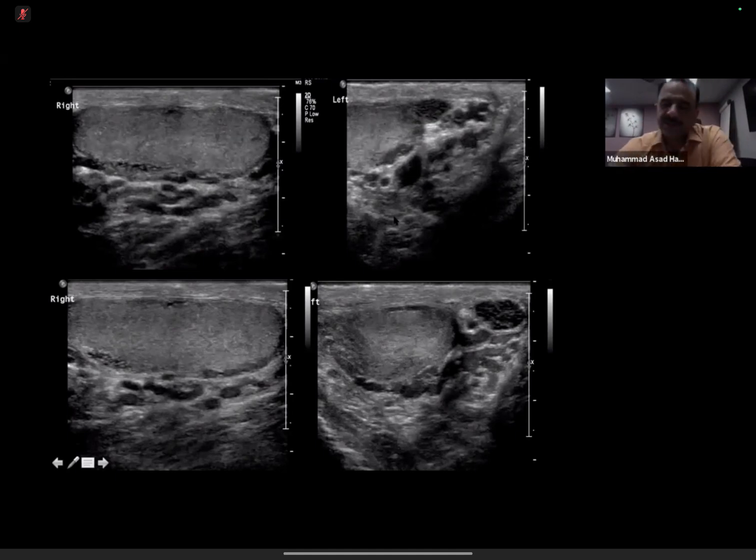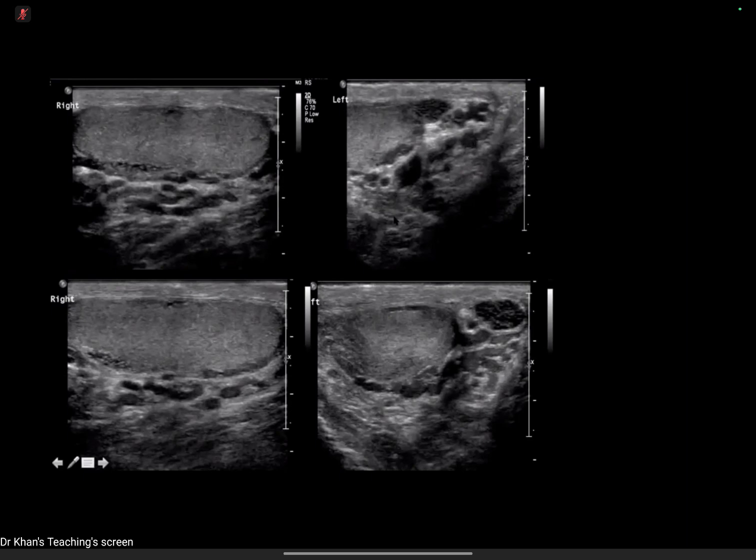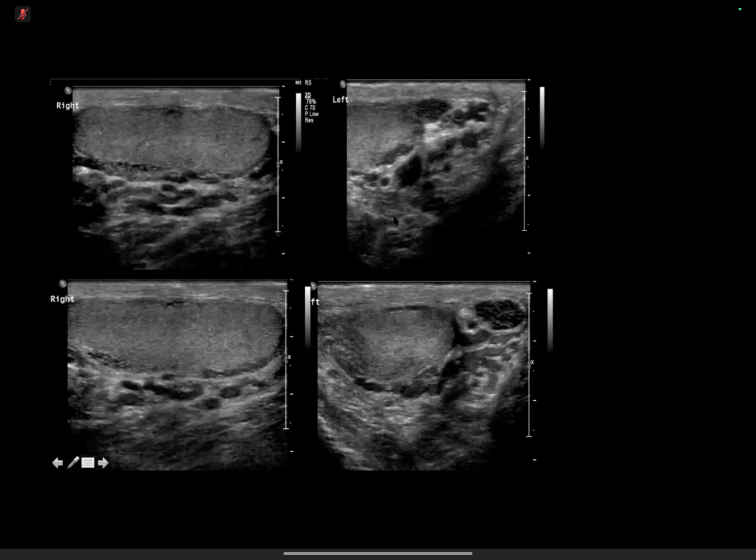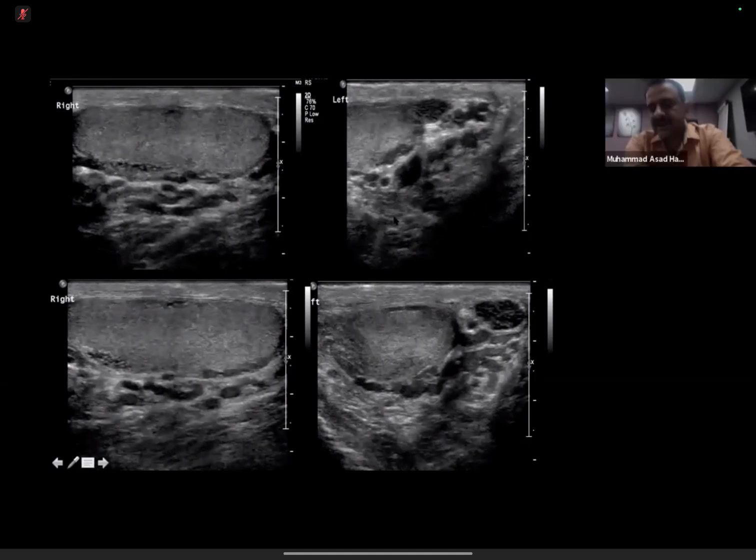So basically, we need to measure the size and look for the reflux. So why do we need to look for the reflux? Because reflux in varicocele tends to be at high risk of progression, and they are amenable for endovascular treatment. Okay, that is one finding. If it is non-refluxing, is it of any concern? Maybe, especially if it's isolated on the right side, I'd be concerned of an obstruction of the renal vein or the IVC. So that is basically the differentiating feature.